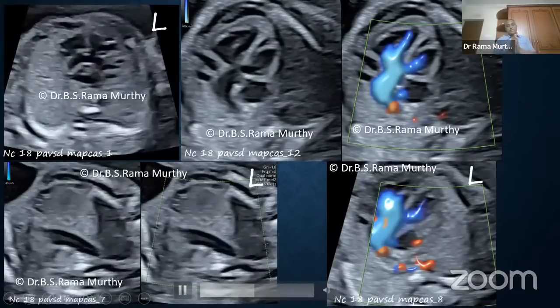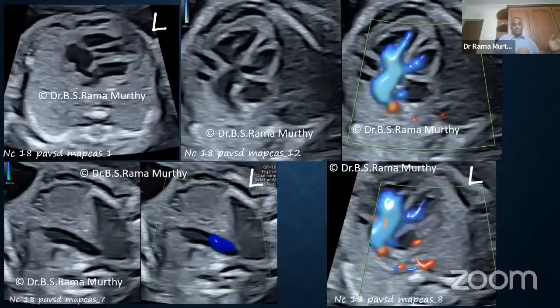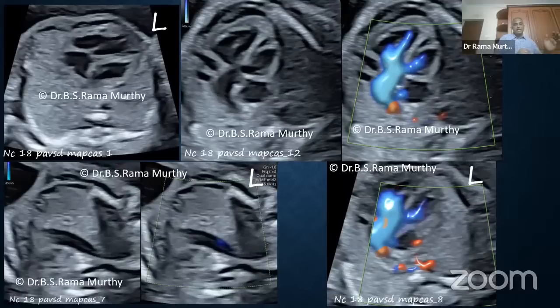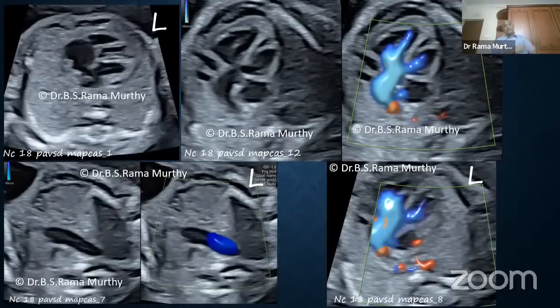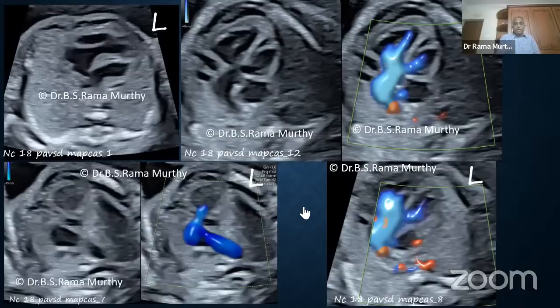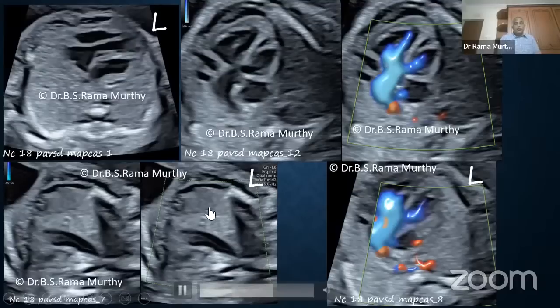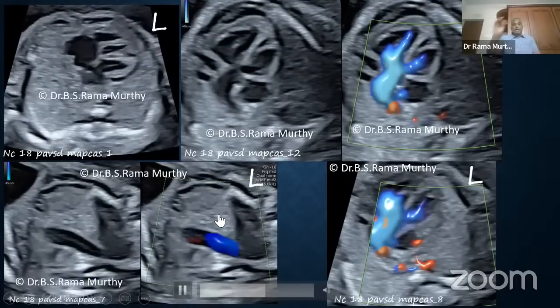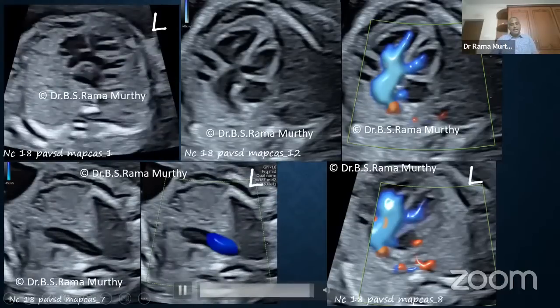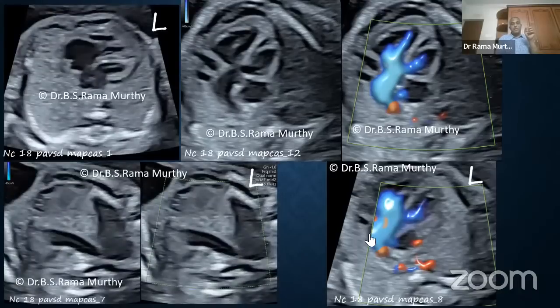It is a large vessel, just as large as what we saw in the previous case of PAVSD, and just as what we saw in CAT, that is common arterial trunk. But I don't see reverse flow in a pulmonary artery. Whatever I do, grayscale, color, high frequency, anything, I do not see a second artery.